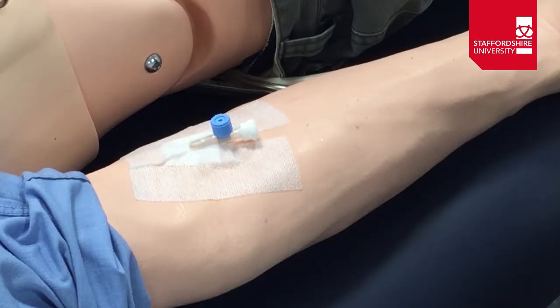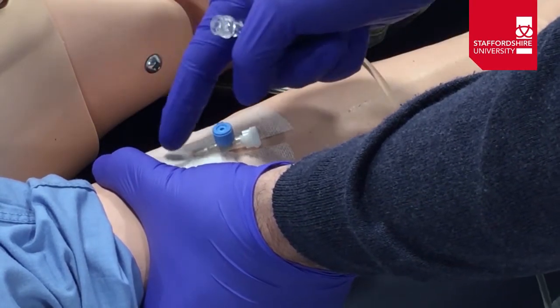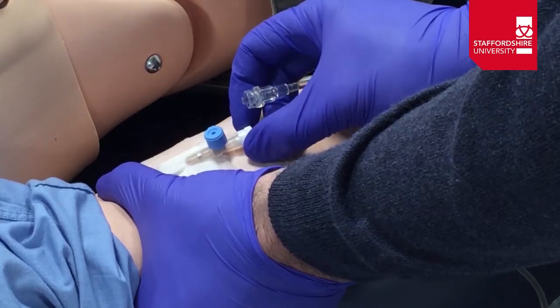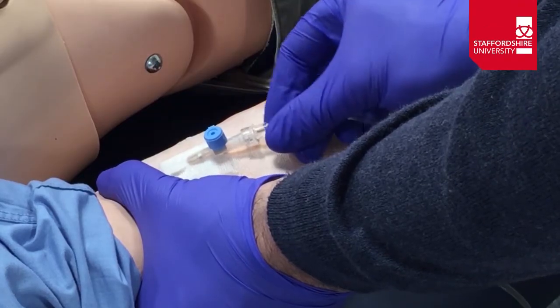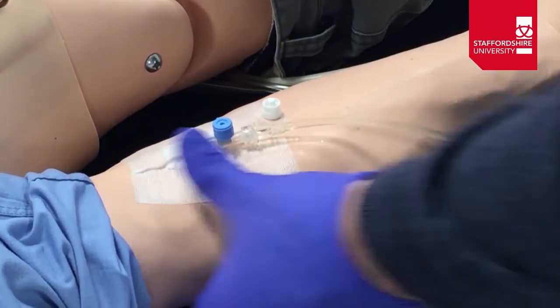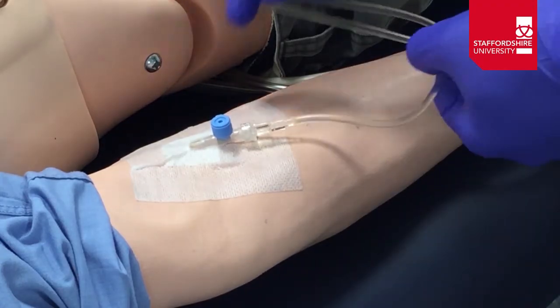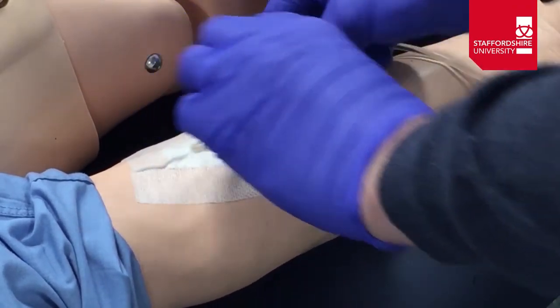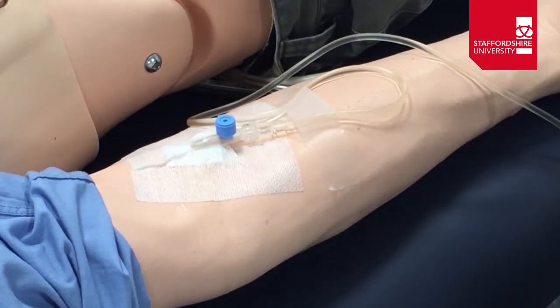We're then going to attach the tubing to the cannula. Apply pressure just proximal to the end of the cannula where it sits in the patient's vein, and remove the cap from the cannula end — this should prevent blood from leaking out. Attach the tubing and screw it gently into place. We can then put a safety loop on the patient's arm and secure it with tape to prevent the tubing being pulled away from the cannula if caught in transit.